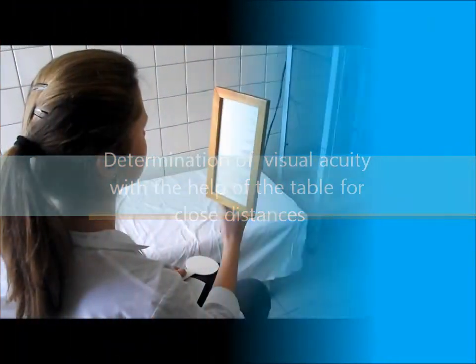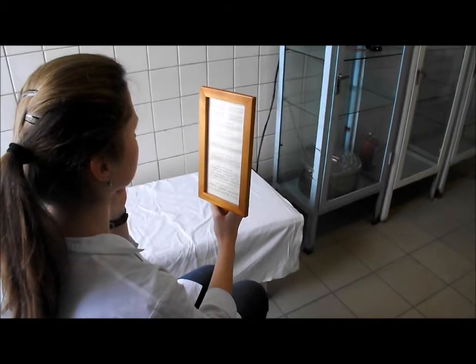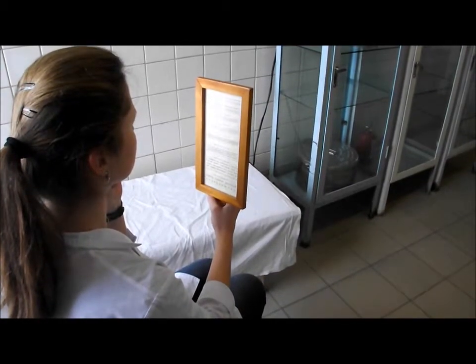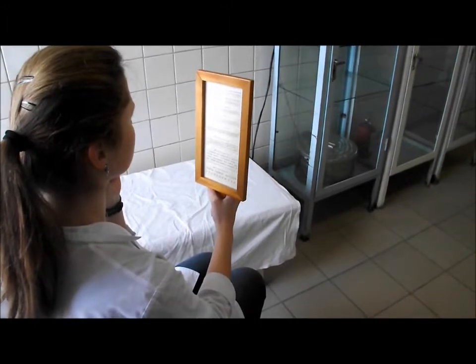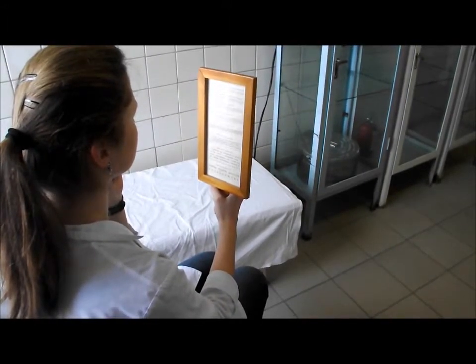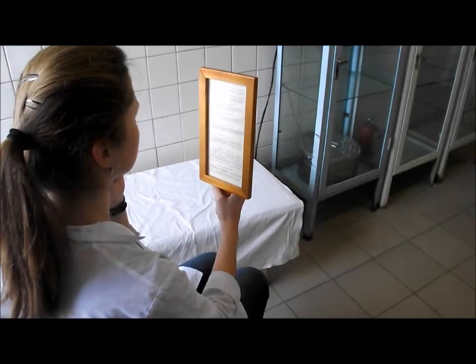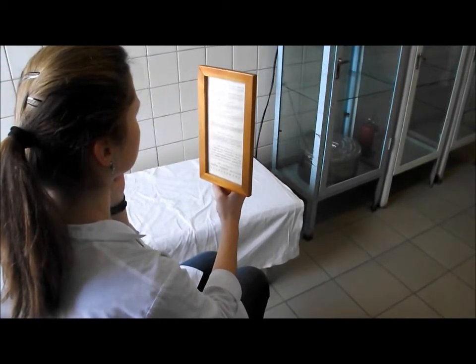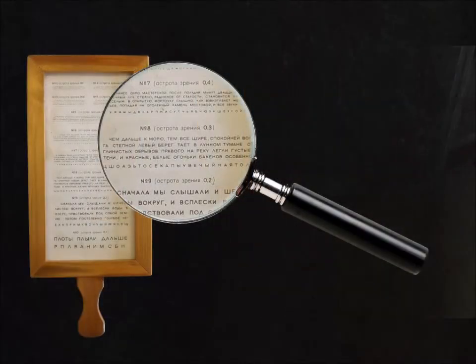At first she should close her eye with a special shield. The person under the test should put the specific table vertically at a distance of 33 cm from her eyes. She should read the smallest letters she can see clearly. She should not only see the letters well, but also read the text easily. Here you can see the visual acuity.